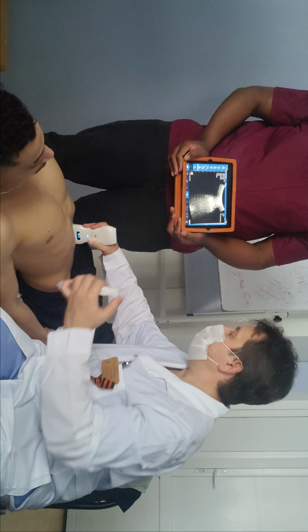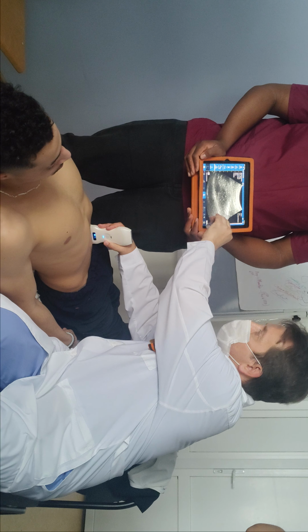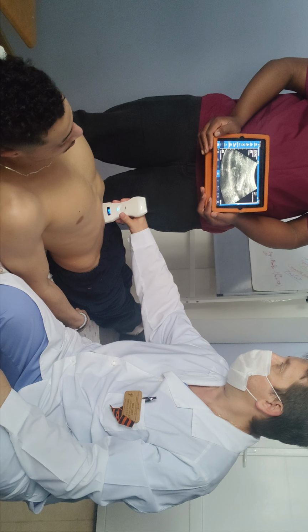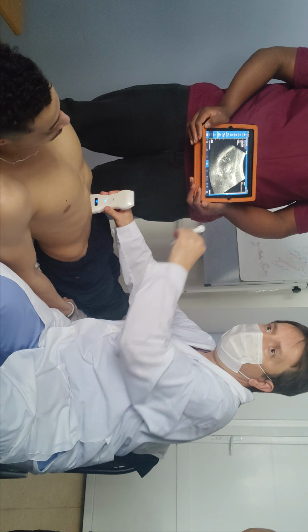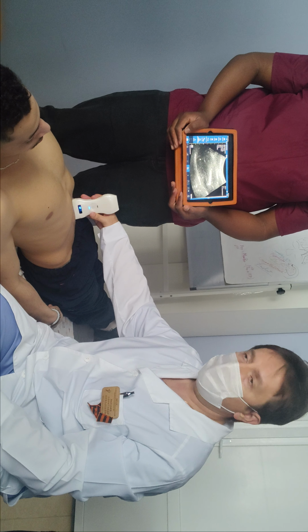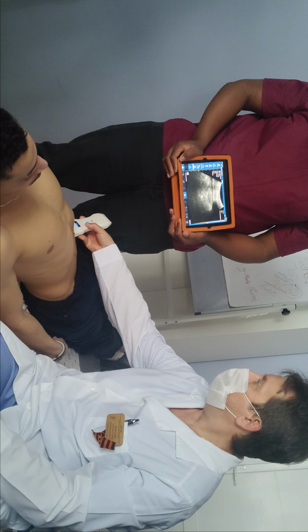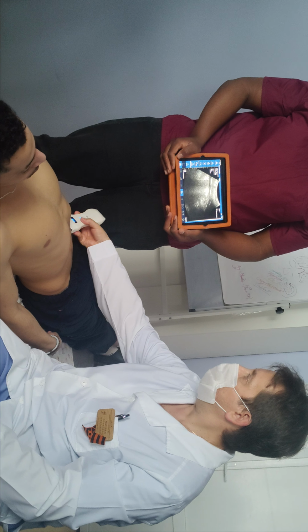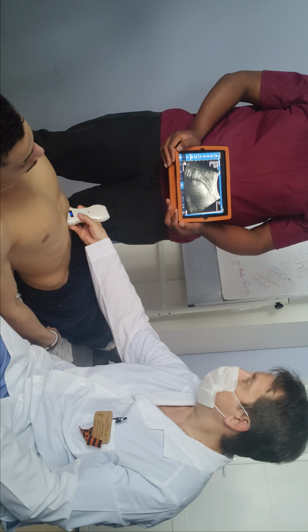Next, we are sliding here, looking for the peritoneal zone. White spot. It is a peritoneal zone. If you transfer in some other direction, you will see another picture. It is also a peritoneal zone. You may shift it, and it is okay. Then you go upward, looking for spleen plus kidney. Spleen is tiny, usually of triangle form.